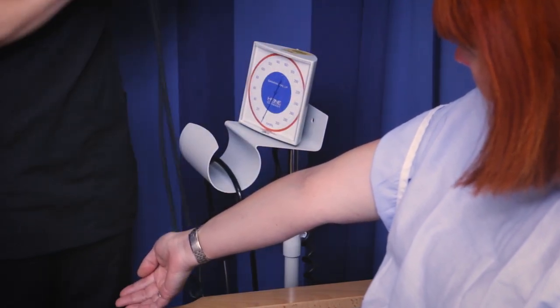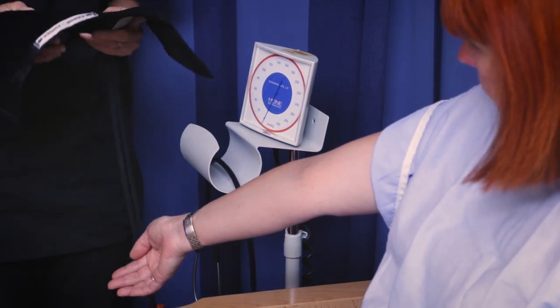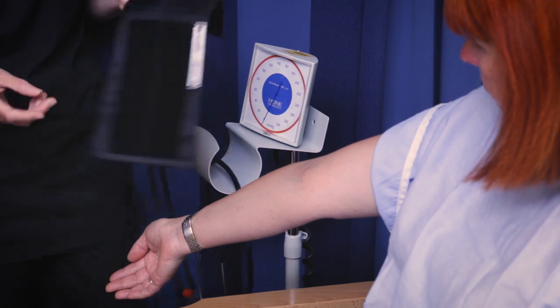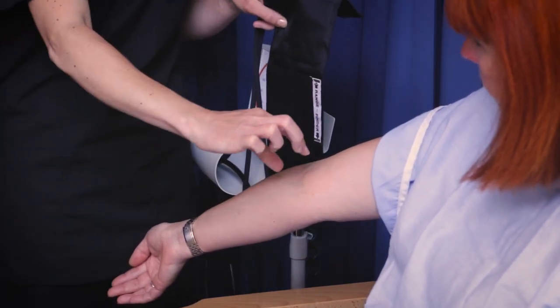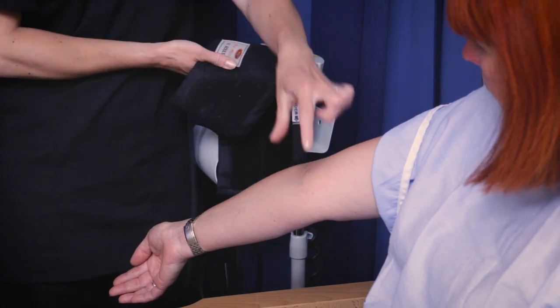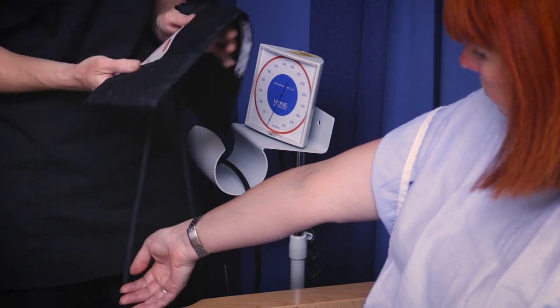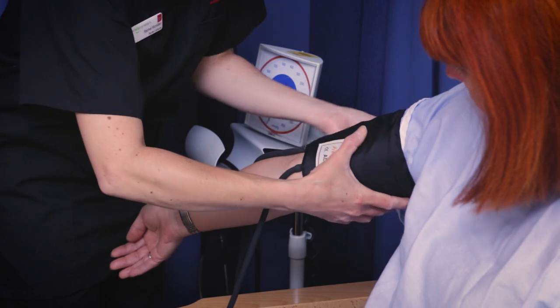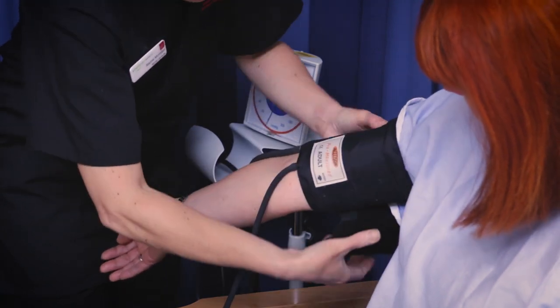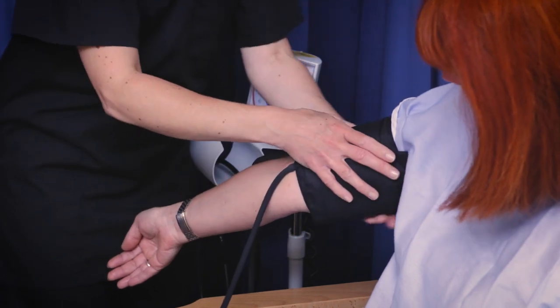What we're going to do now is place the cuff on the arm. You need to make sure that the cuff is an appropriate size for the patient. Because I've noted where the brachial artery is, I'm now going to place the cuff a few centimetres above that, because that's where I'll need to put the stethoscope. If you notice on the cuff, there's a little arrow saying 'artery' and that's where you place the cuff. You just need to wrap it around snugly.